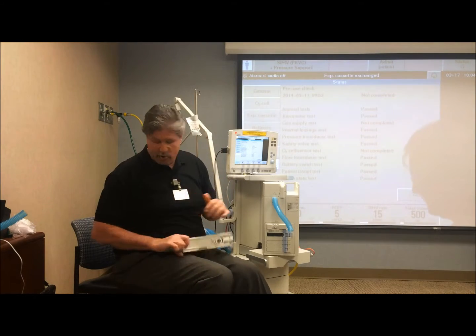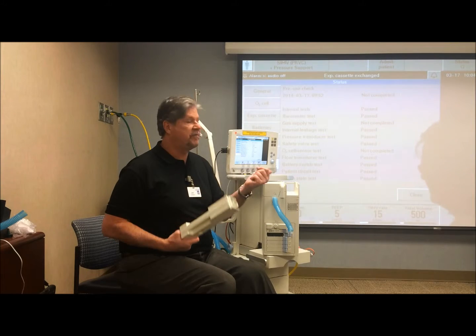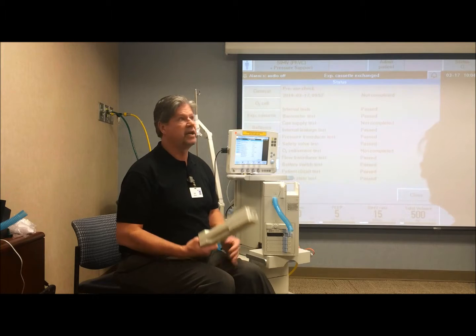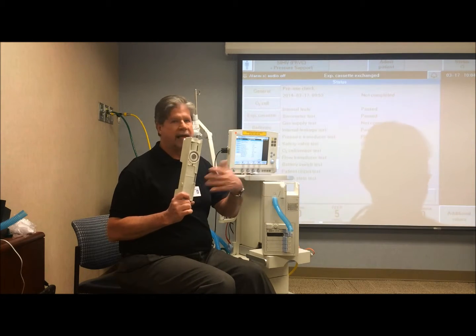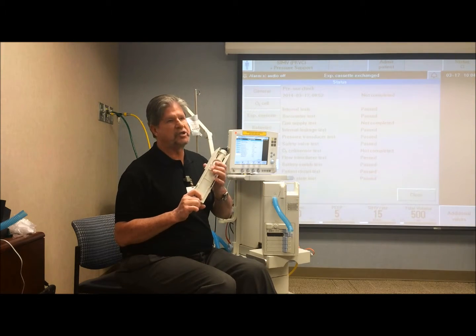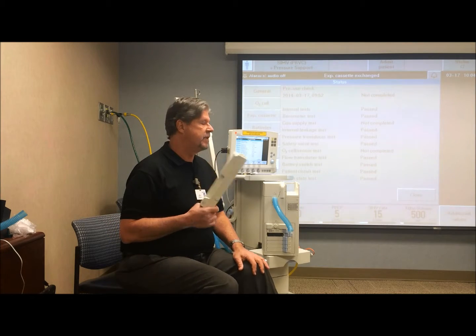If you got the smaller one, just tip it and tap it in your hand, and if you had water in your hand, put it back in the machine, it'll work fine, because a little water bubble impeded the accurate measurement of pressure. But if it's a larger one like this, the new style, it's most likely drained out and it's not a water issue.